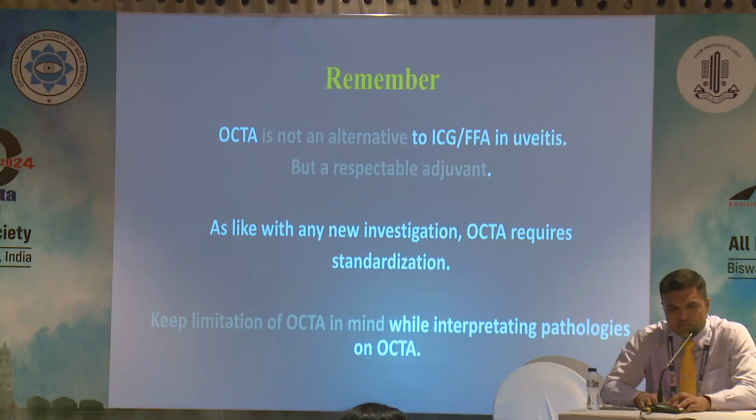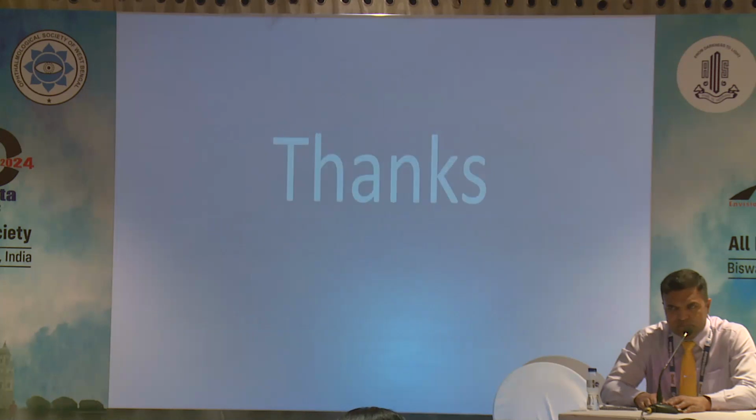In the end, I would just like to say that OCTA is not an alternative for ICG and FFA in uveitis, but a respectable adjuvant. As with any new investigation, OCTA requires standardization. Keep the limitations of OCTA in mind. Know that it doesn't detect blood flow in vessels which are very small, and inflammation can also alter blood flow detection. So keep that in mind while interpreting pathologies in OCTA. Thank you.